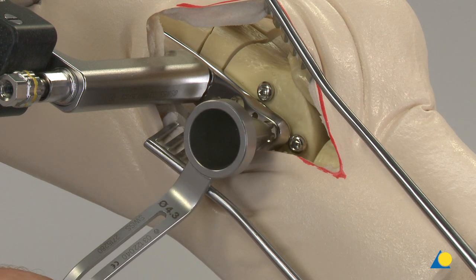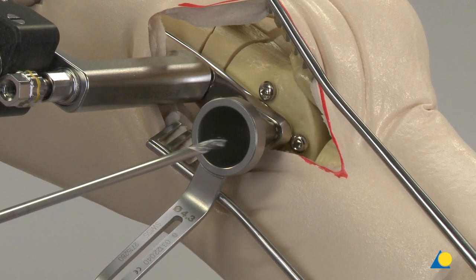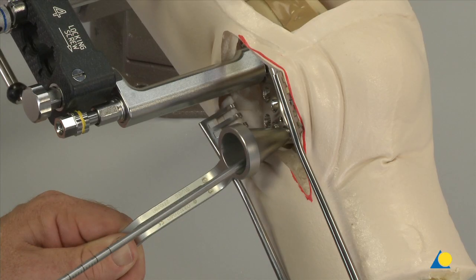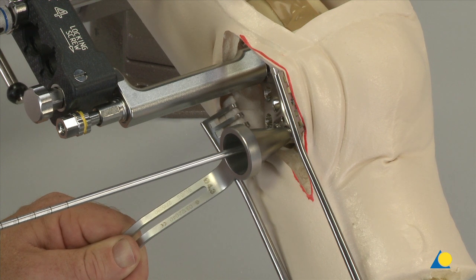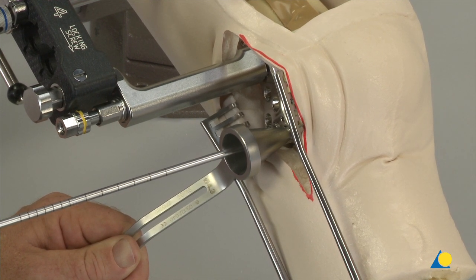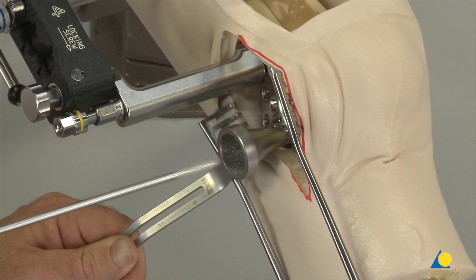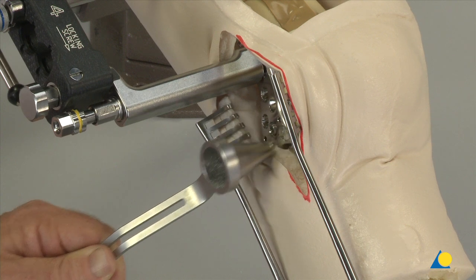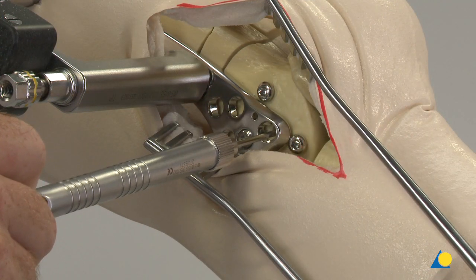Ensure the cone-shaped end of the double drill sleeve keys into the cloverleaf hole. The drill bit can be angled in the cone to the desired direction. Remove the drill sleeve and use the depth gauge to measure the screw length needed.